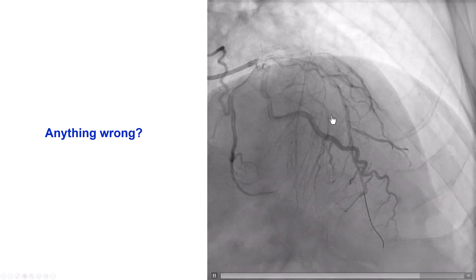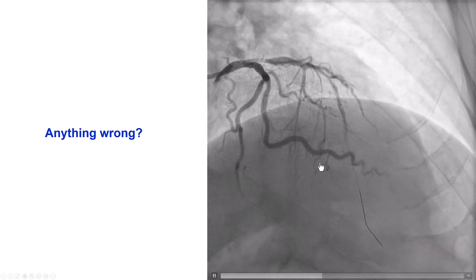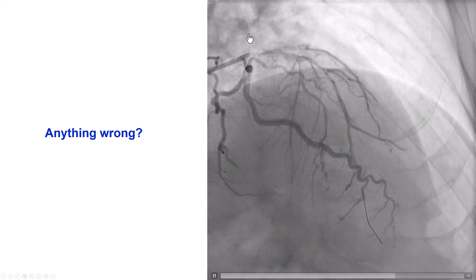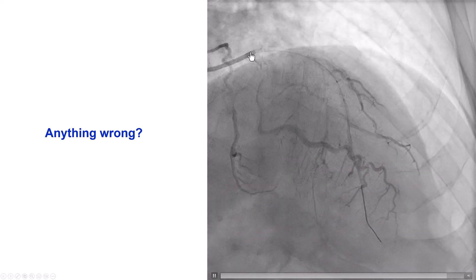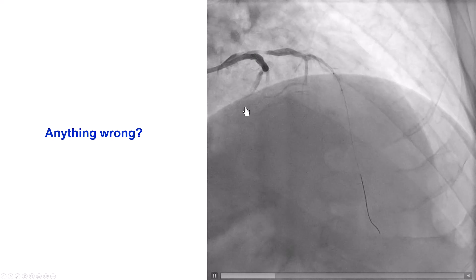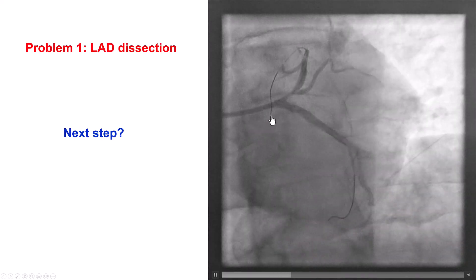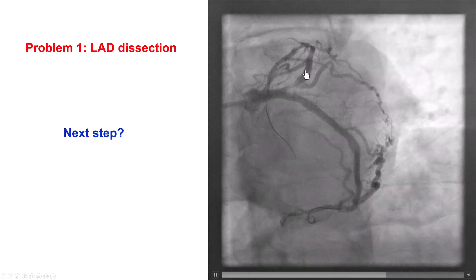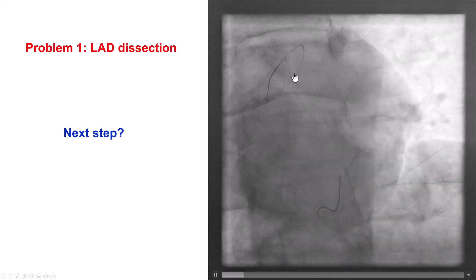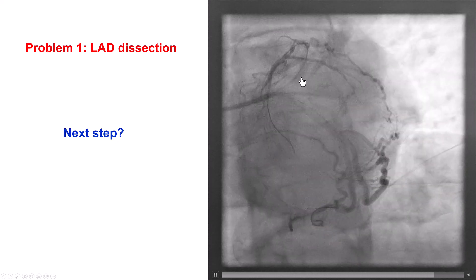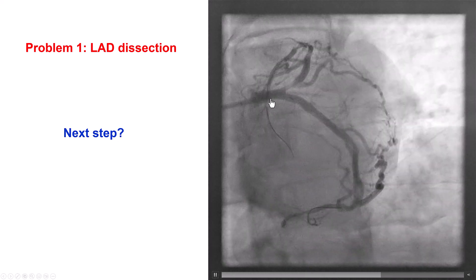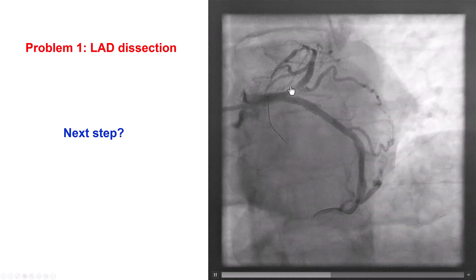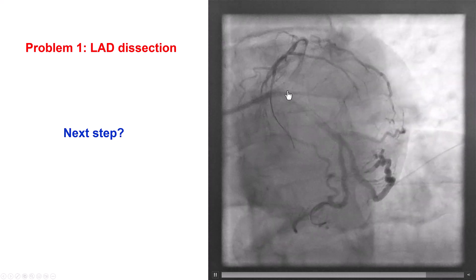But if we look at the image, there is something else going wrong, and this is the point of interest. We do have haziness into the proximal LAD. This is a different picture that highlights that we do have an area of haziness, likely a dissection from the guide into the proximal LAD.